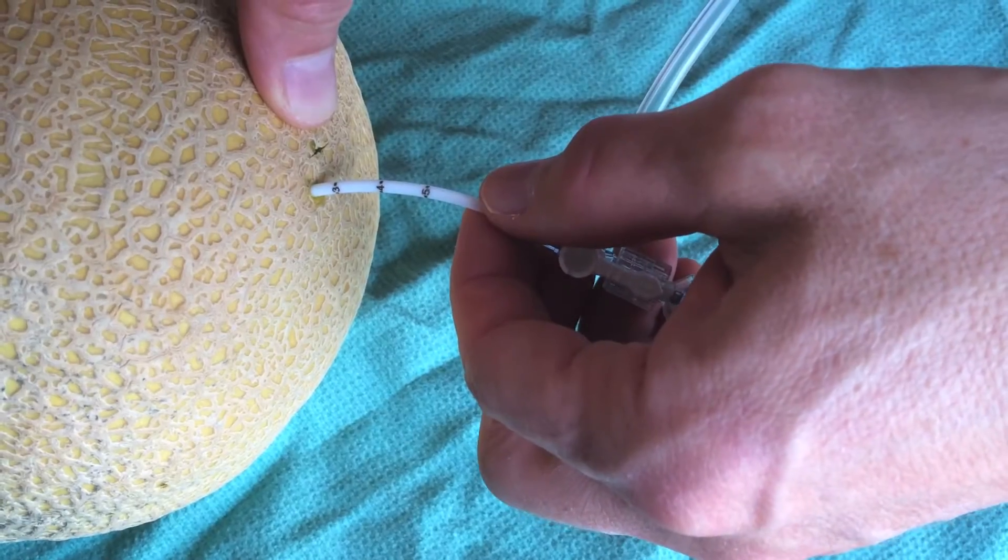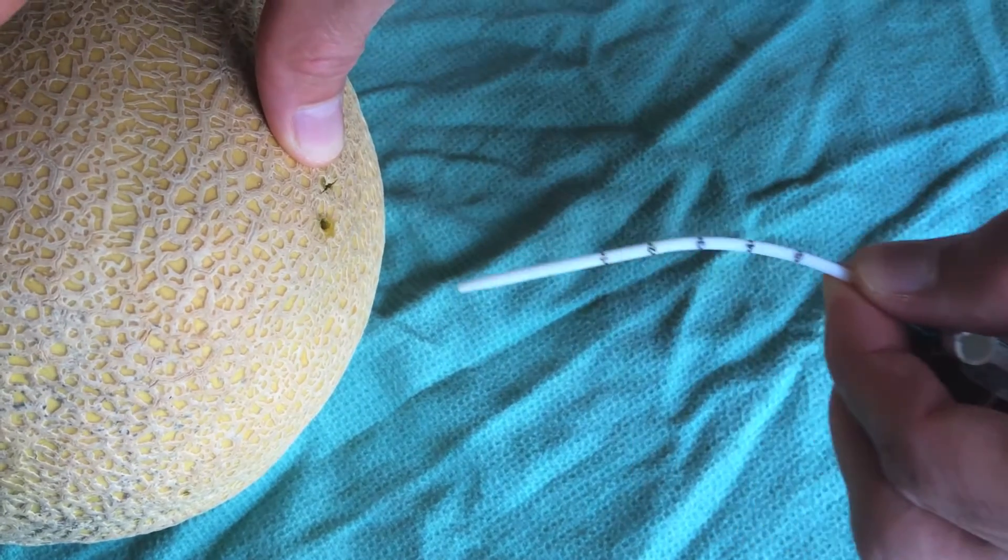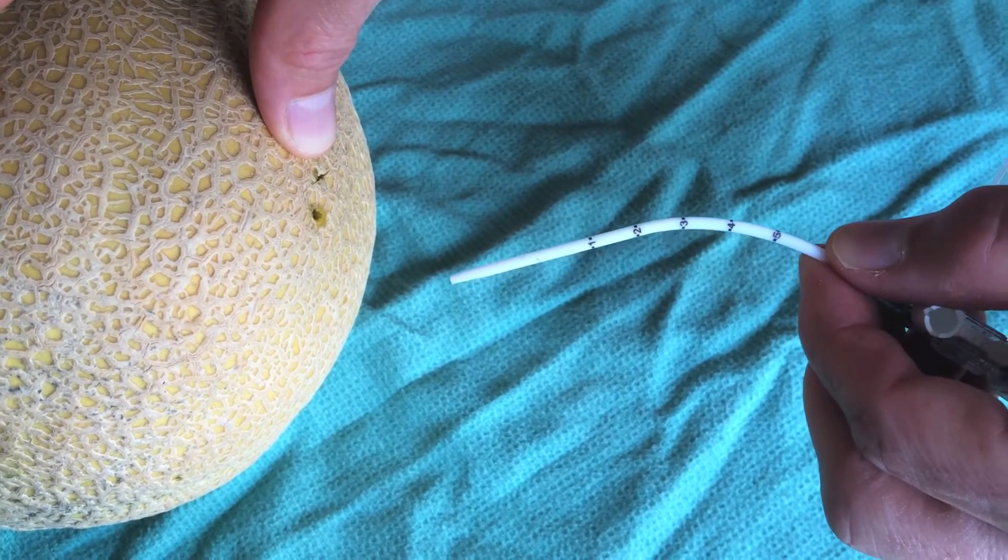Once drainage is complete, pull out the catheter and provide the usual post-procedure care.